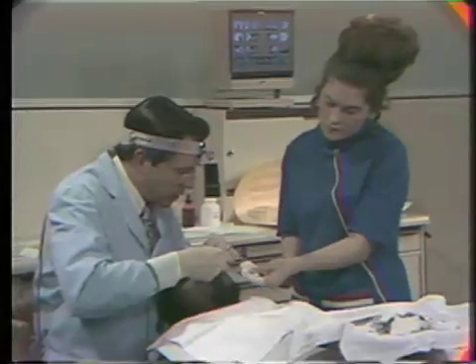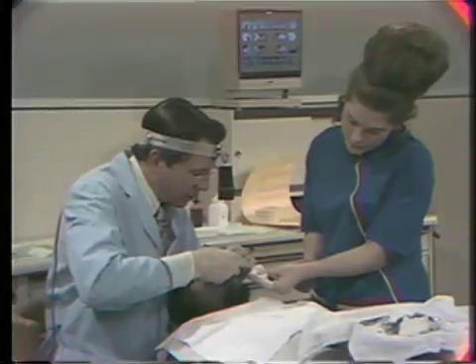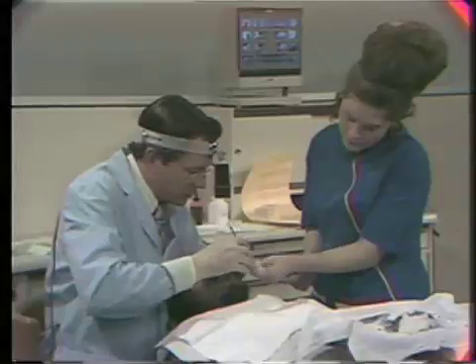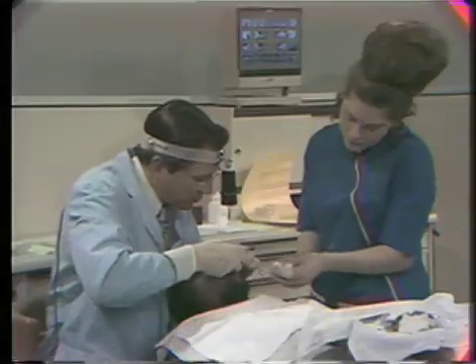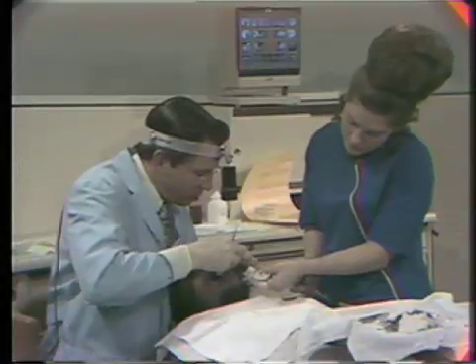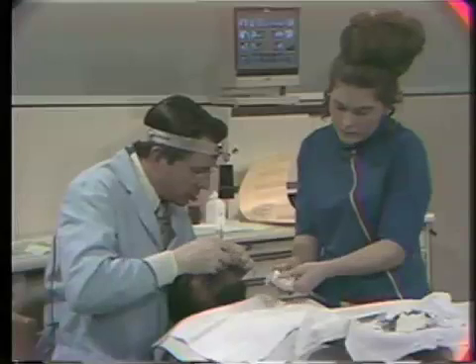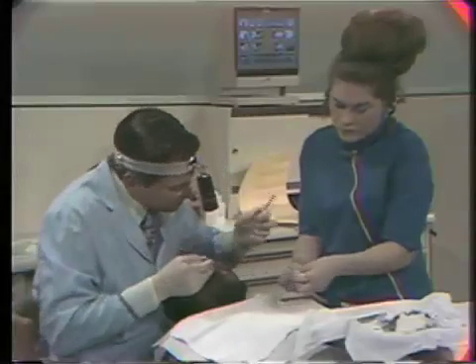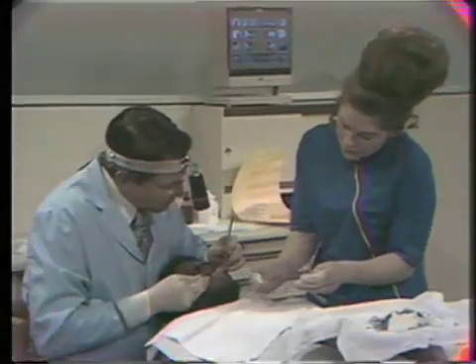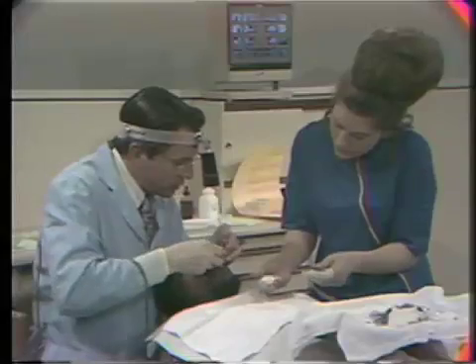You can notice I'm trimming off the excess on the labial surfaces of these teeth, and Betty's picking up the excess material all the time. She's right there with the sponge. During this procedure, we would have the other assistant writing on the record, but since we only have one assistant with us, she'll go to the record now and write on there the procedures that were done, so I'll dictate it to her.